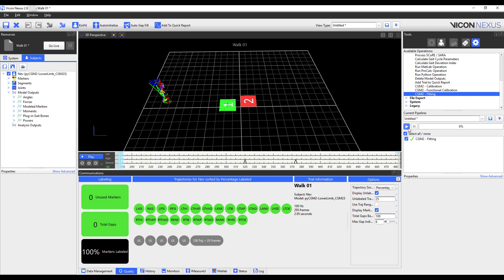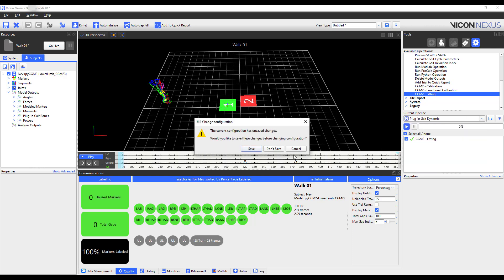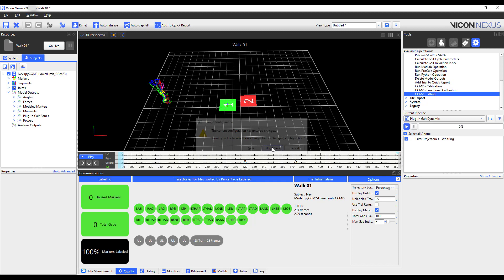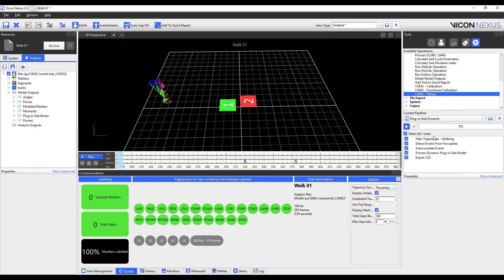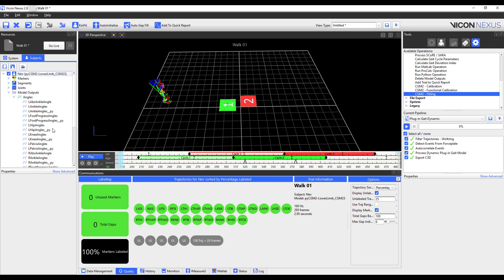When finished, I will run the plug-in gait dynamic pipeline, so that I can compare model outputs, as well as generate events for normalization. I can then verify that my model outputs have been calculated, and actually plot them against each other.